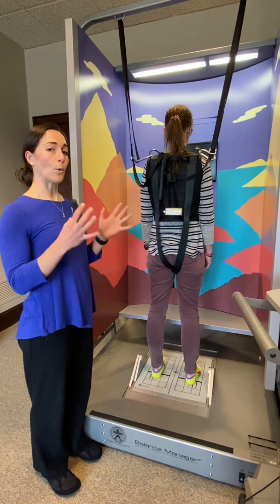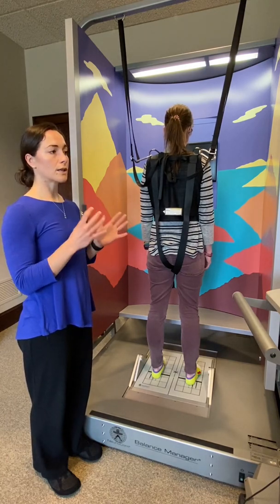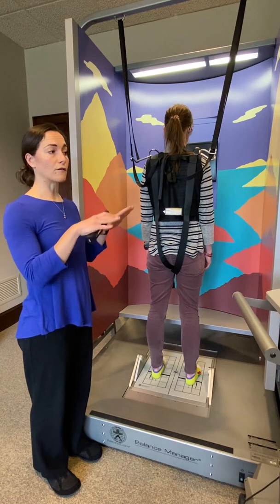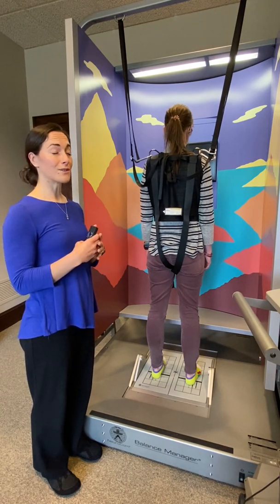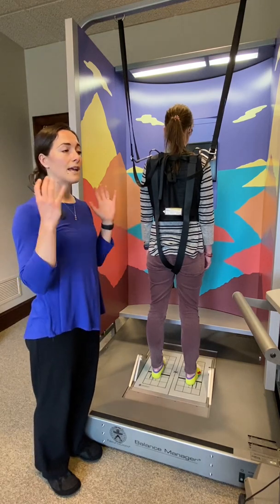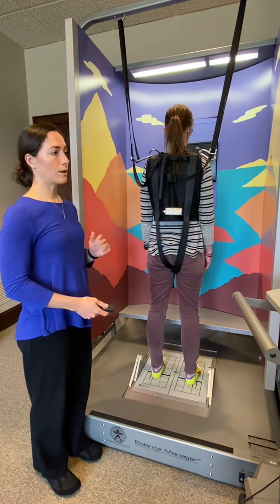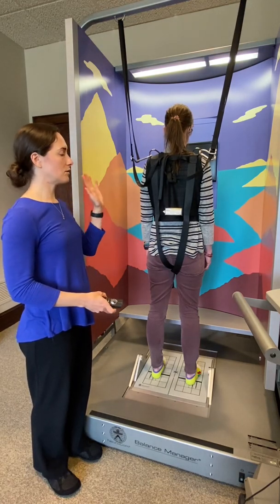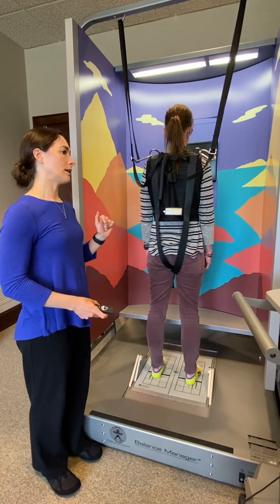Condition three is eyes open, but the walls might move. Condition four is eyes open, but the floor might move. Condition five is eyes closed and the floor might move. And condition six is eyes open and both the walls and the floor might move. So this is condition three, with the walls possibly moving and the patient's eyes will be open.